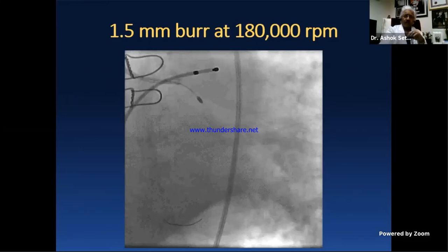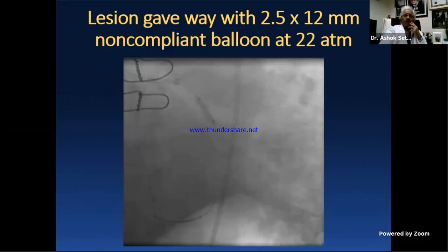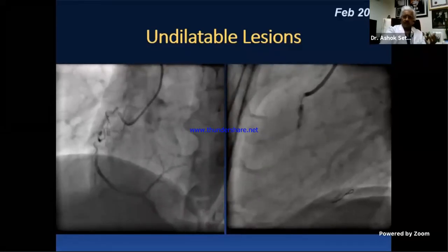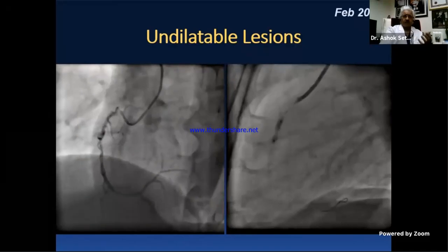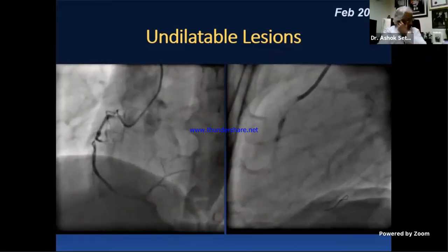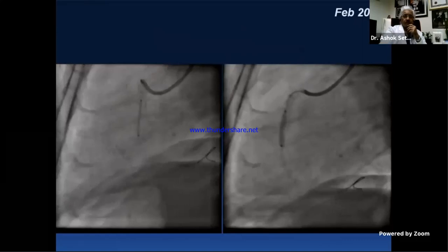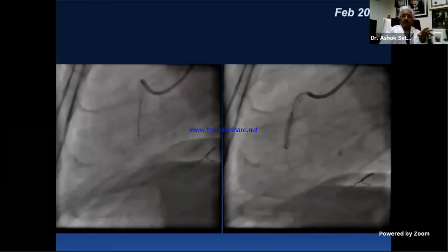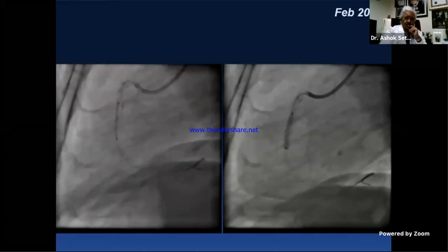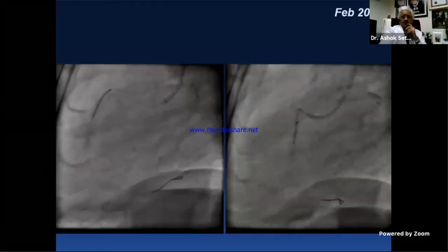Well, like it or not, this continues to happen even in the present time; you keep seeing these lesions. So let's take you through this, because we clearly need to understand that even these happen. We're talking about February 2018, where there's a high-grade stenosis that looks innocuous, but I'm sure has a napkin-ring calcification, because the operator sees a balloon not dilating. Despite this, a stent gets implanted into this vessel, firstly moves distally, and only the proximal part of the stent is partially in the lesion. Having realized it was missed, another stent goes in, and this misses the lesion also and goes proximally. Then we still have a lesion in between.